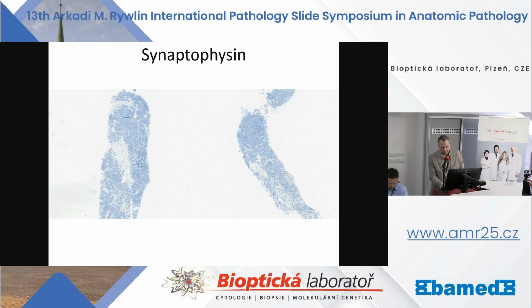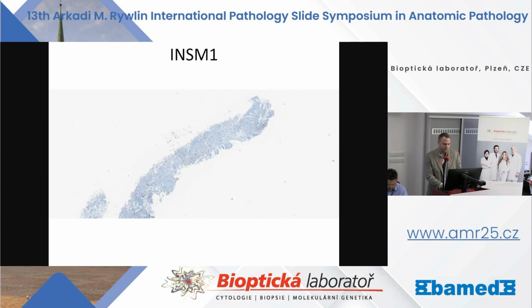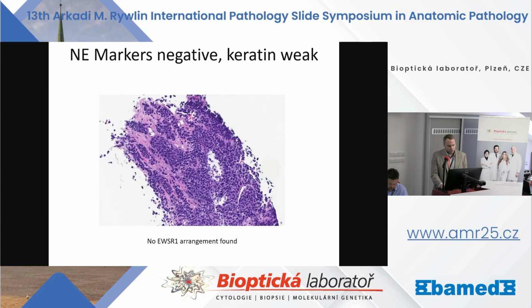But synaptophysin was completely negative, as was chromogranin. And INSM1 had patchy, rare single cells positive. I should mention CD45 was negative as well. So small cell carcinoma would be the most accurate diagnosis, I guess, though without history it makes a question.